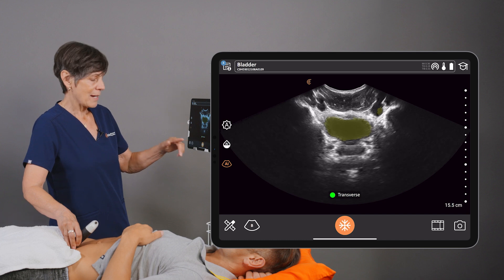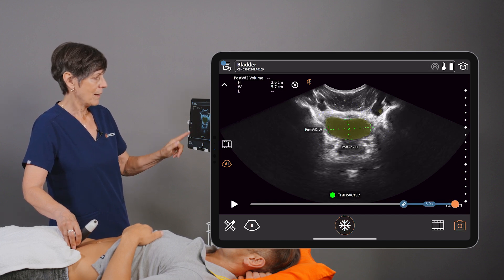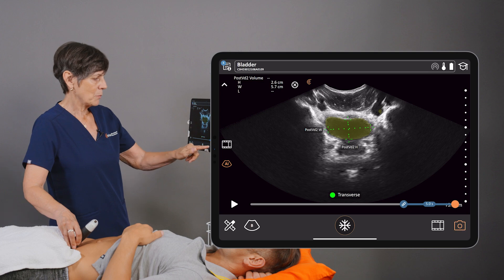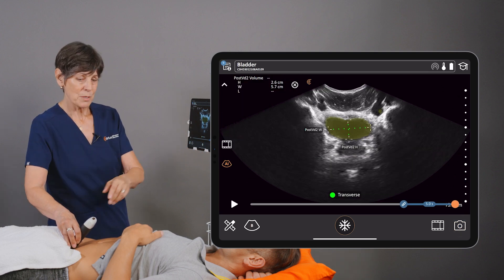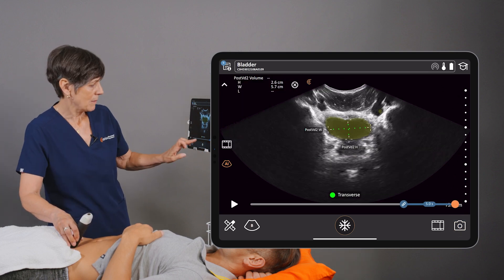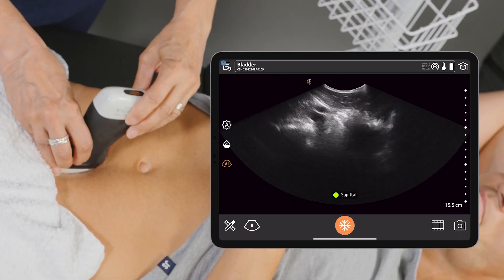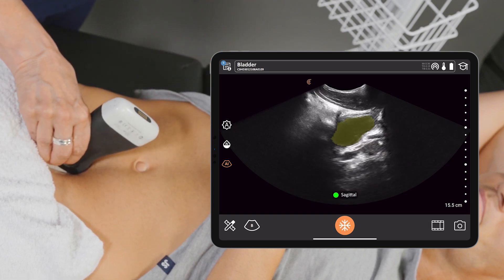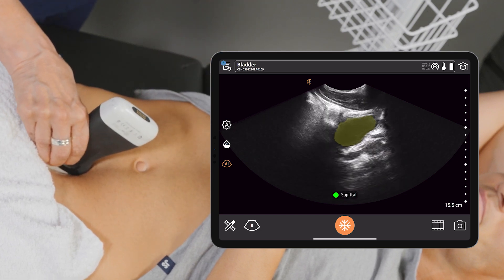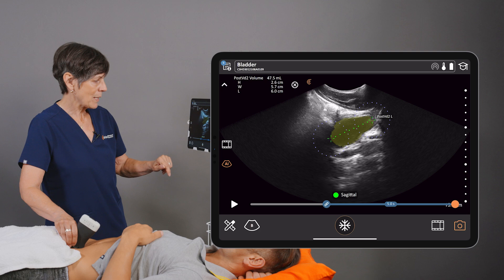Once I am happy with my image, I can freeze it. We'll take an image to save those measurements, and I'll rotate my scanner 90 degrees to get the sagittal view, and again we'll hit the freeze button.